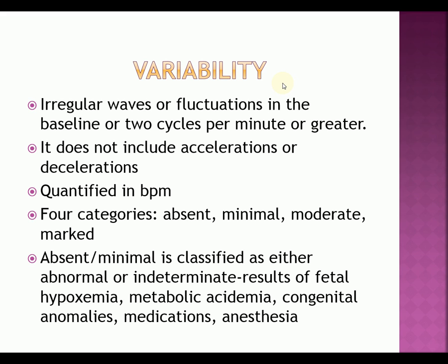This is going to be on your exam, so on your fetal monitor exam. So you want to be sure and make a note of that so that you can go back to this when you're taking your exam and be able to tell me what those amplitudes are. When you have absent and minimum, they are abnormal. You do not want absent or minimum variability. This will worry you more than late decelerations.